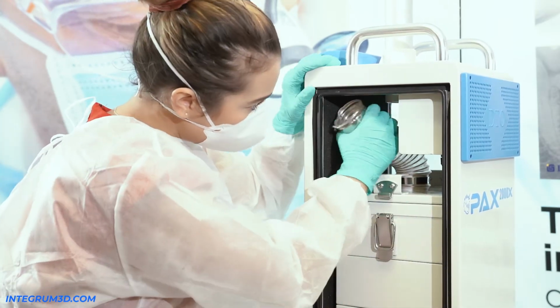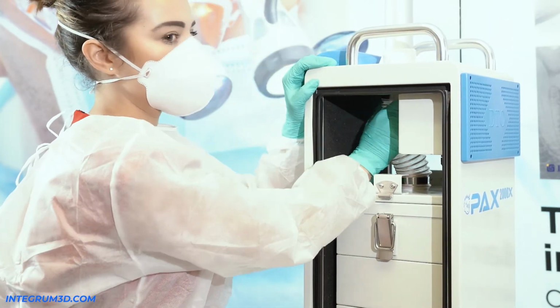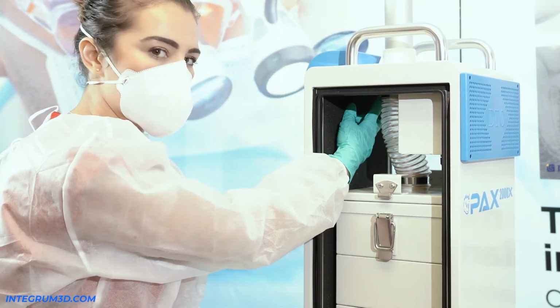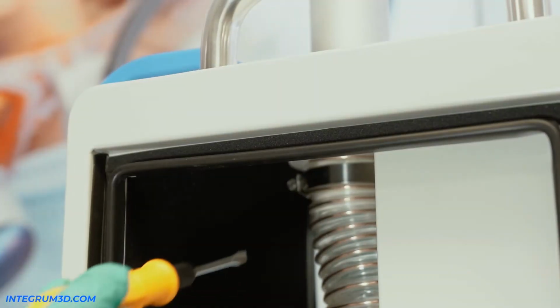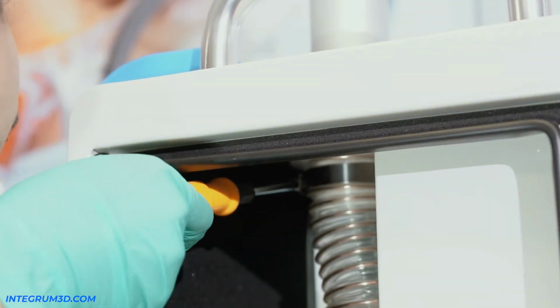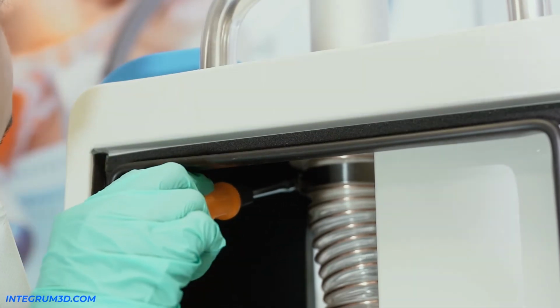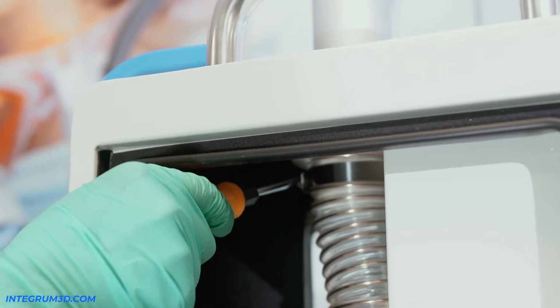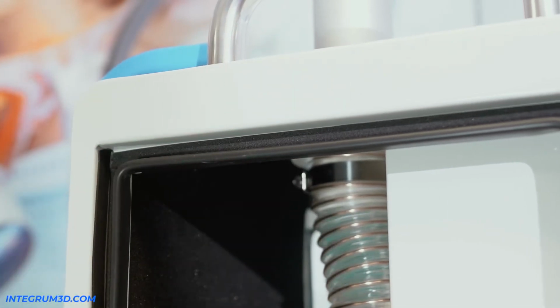All the way down, match the tubing up with the pipe down here, and then I'm going to put the screw in and tighten it back up the way it was. I'm going to continue to tighten this all the way to the right, as much as I can, so that the clamp stays in place here, just like that.